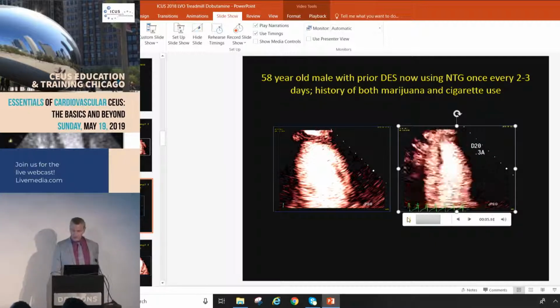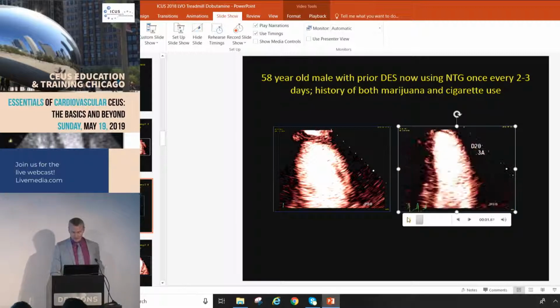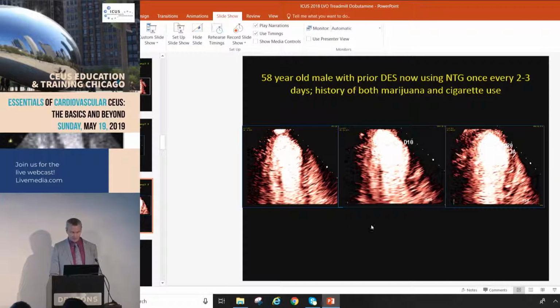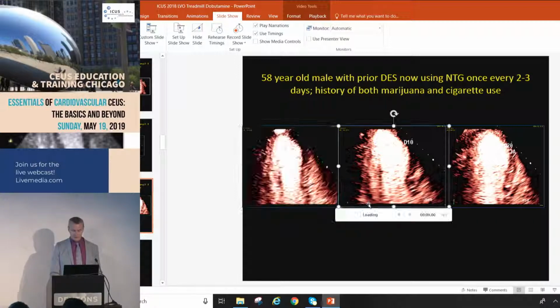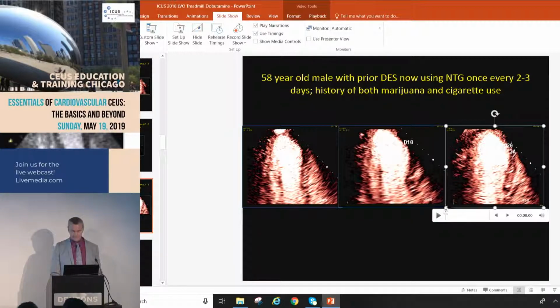So we called inferior and distal septal and apical and distal anterior, as you said. And then here's the three chamber. We use these three views day in, day out. We don't use the parasternal so much. We just use these views, especially during dobutamine. Now exercise will grab some of them as well. I happen to agree with you on apical 2, 3, and 4 versus parasternal.